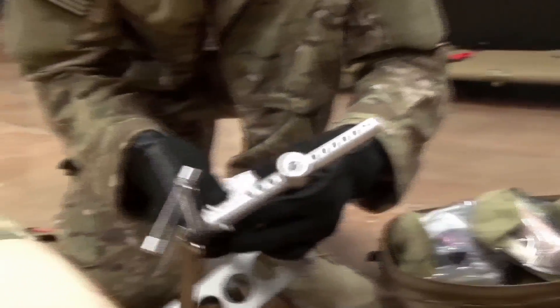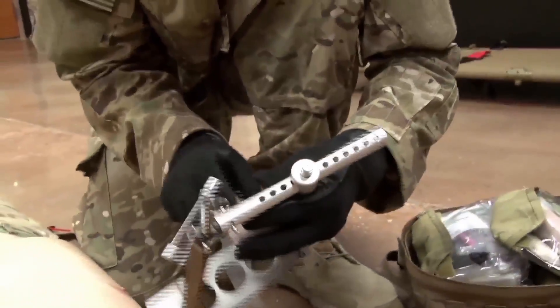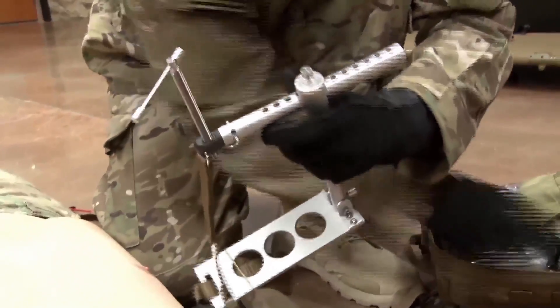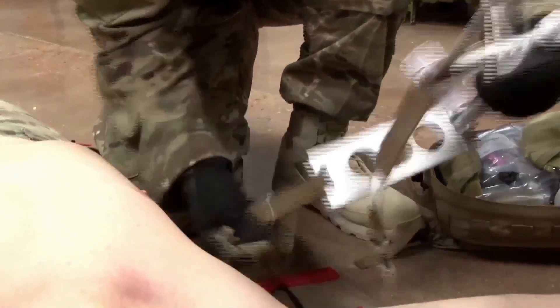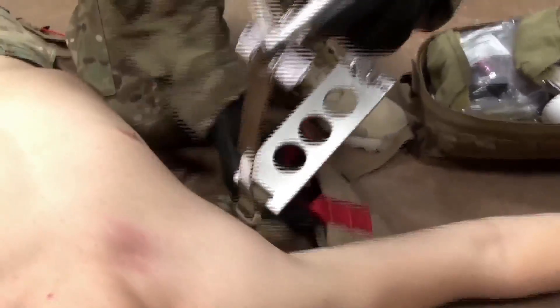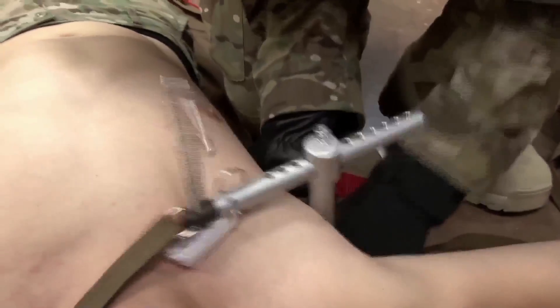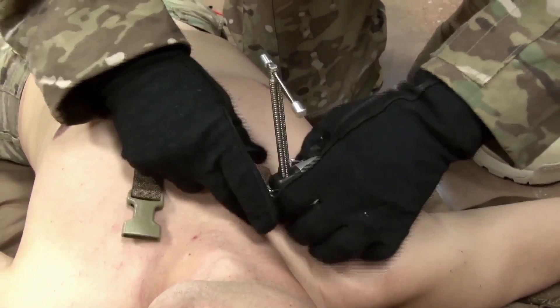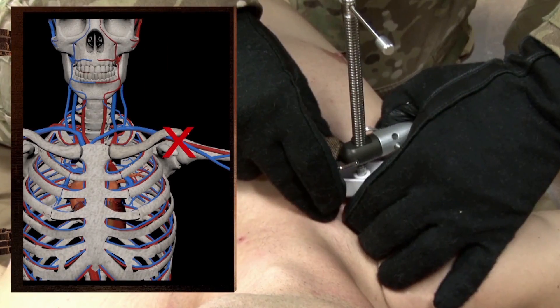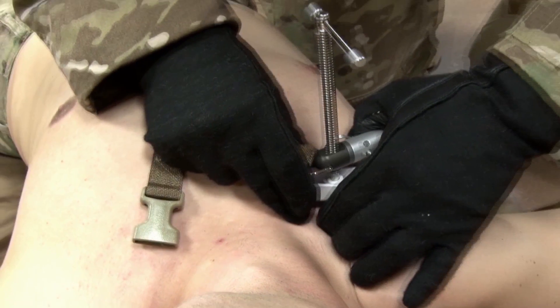Press one of the release tabs to remove the large disc head and reveal the square pressure disc. Position the base plate under the patient beneath the scapula. Ensure the vertical arm is in contact with the patient on the wounded side in close proximity to the wound location. Locate the deltopectoral groove on the injured side. Ensure the pressure disc parallels the clavicle at the proper angle.